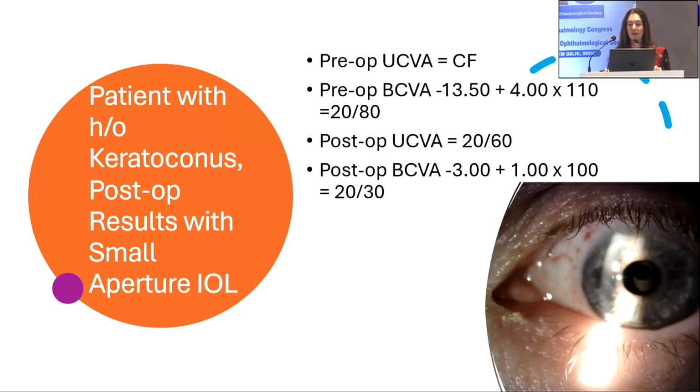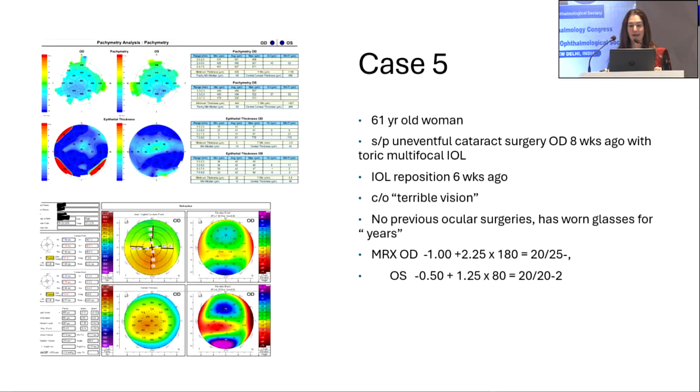Here you can see this was pre and post-op, and you could see the IC8 is nicely centered, and you do get a variable amount of astigmatism correction with the IC8, but again, we're going for improvement, not perfection, since these are abnormal eyes.